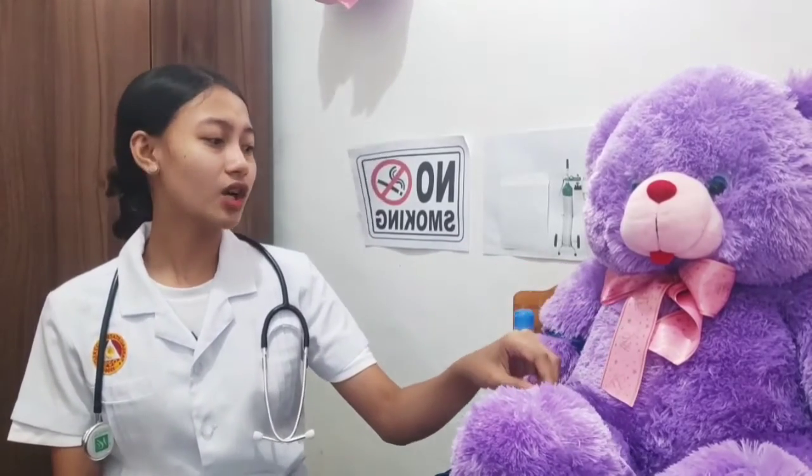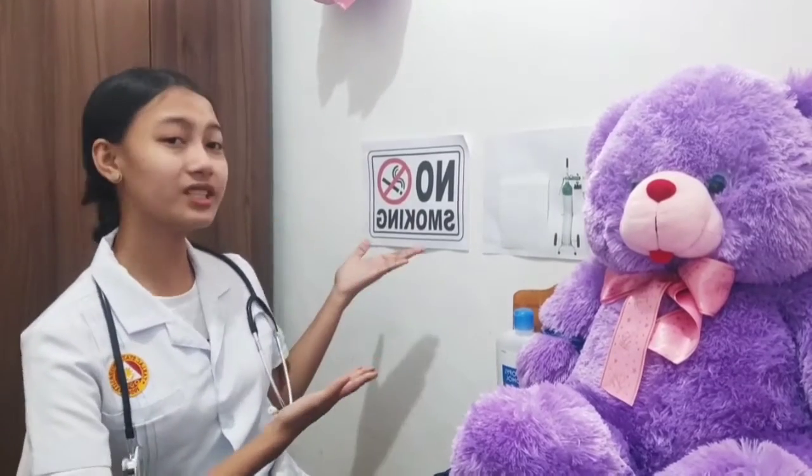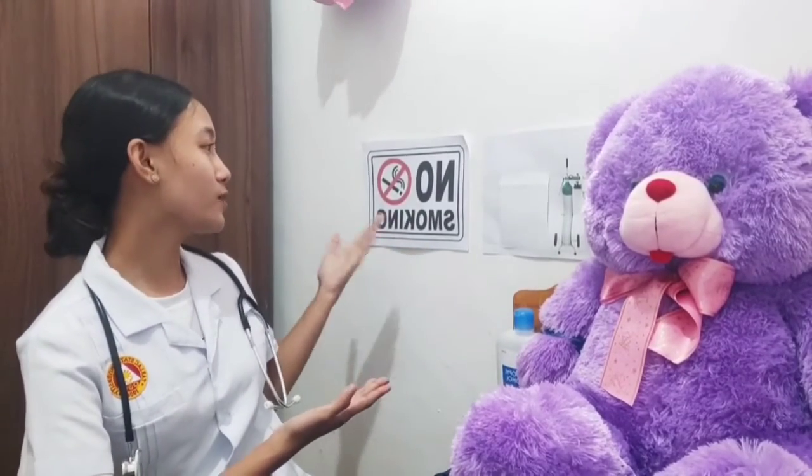For the planning, we have to assemble and prepare the equipment needed for this procedure. We have two oxygen supplies with a flow meter and adapter, a humidifier with distilled water or tap water according to agency protocol, a nasal cannula, tape if needed, and a no-smoking sign.